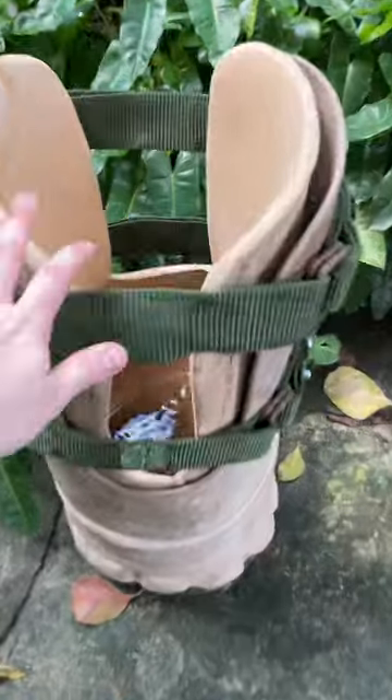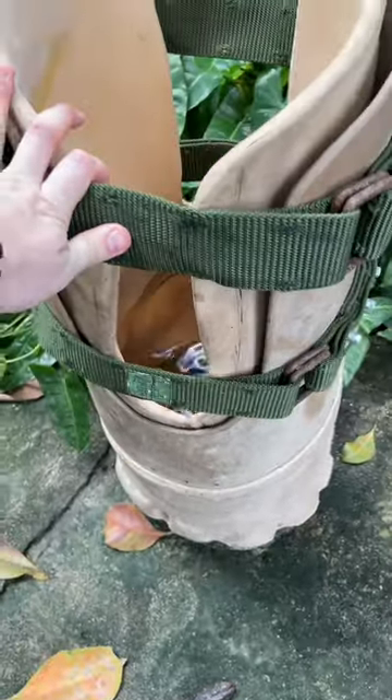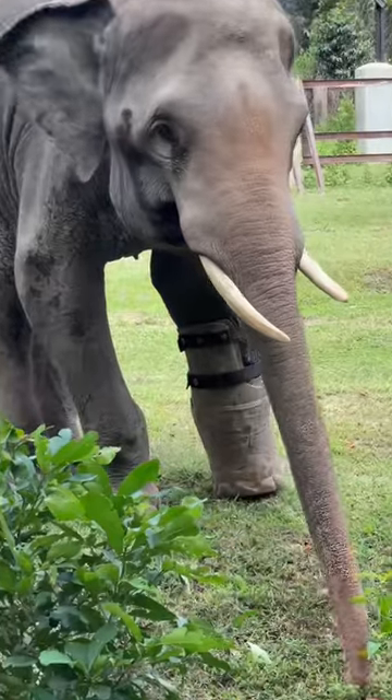So the team provide him a prosthetic foot every six months which my family charity Paris Wildlife Park donates the funds for. Here's how they do it.